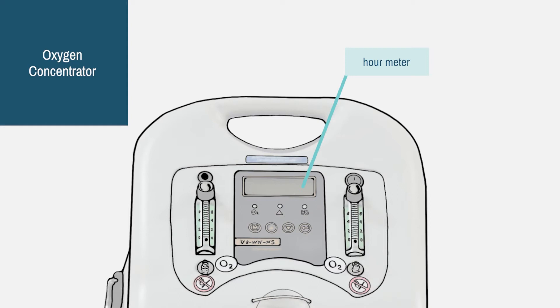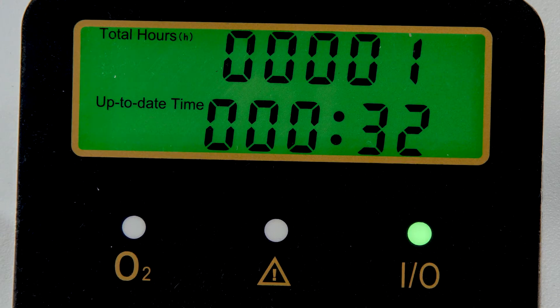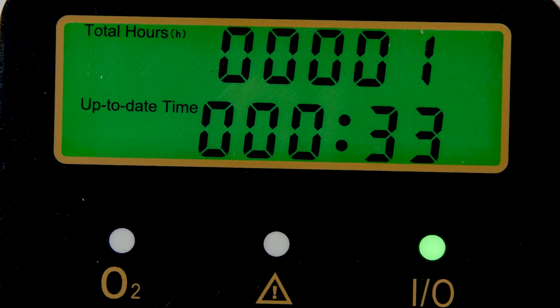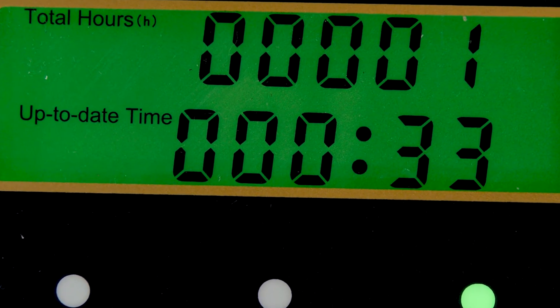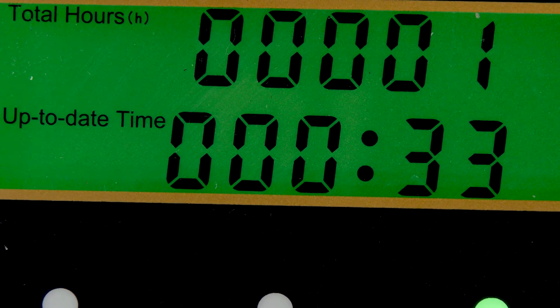The small display between them is the hour meter. This has two lines of numbers. The top line records the total hours the machine has been used — this is a new machine, so it has only been used for one hour so far. The line below shows the running time since the machine was last turned on. So in this session it has been used for 33 minutes. The number will go back to zero when you turn the machine off.